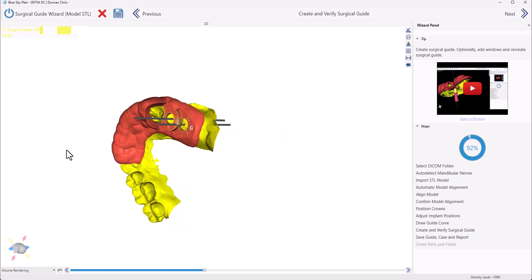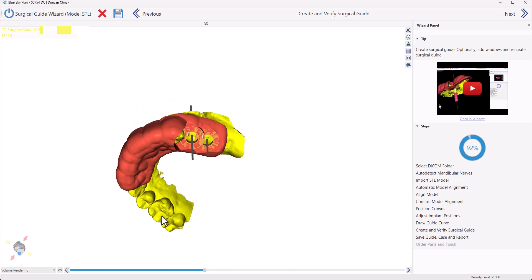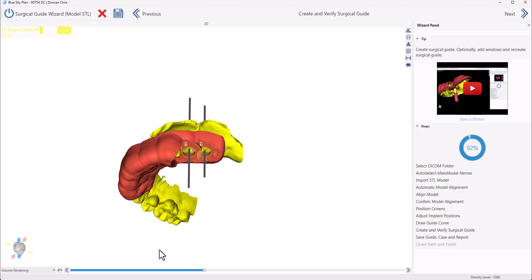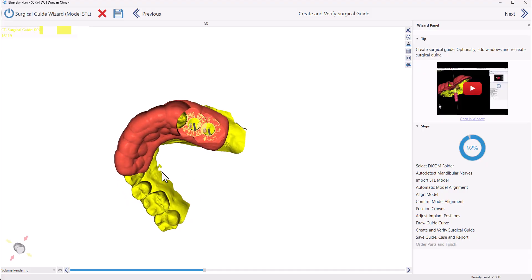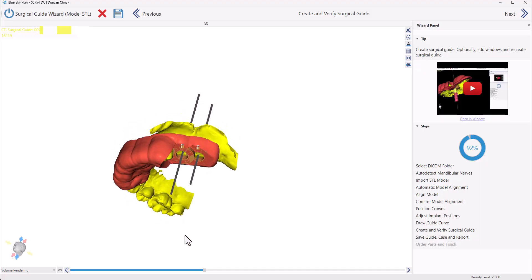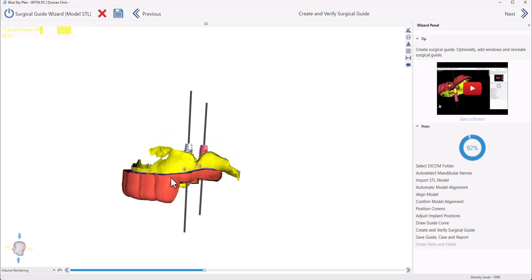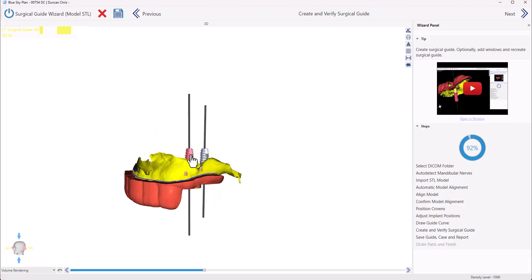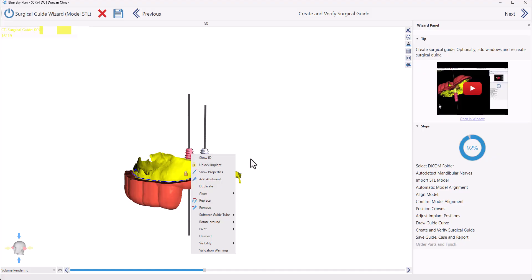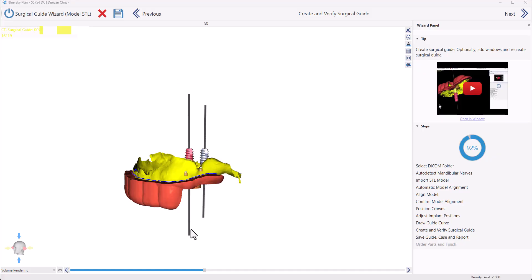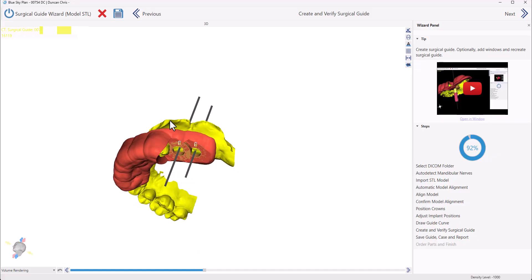The surgical guide has now been created. We could see that the vertical axis of the implants goes through the center of each relevant osteotomy hole. At this point, and in the previous step as well, the implants are automatically locked to make sure we don't move them accidentally while reviewing the case. If needed, we could right-click and choose Unlock Implant. We are now going to proceed to the final steps of saving the case and the relevant information by clicking Next.